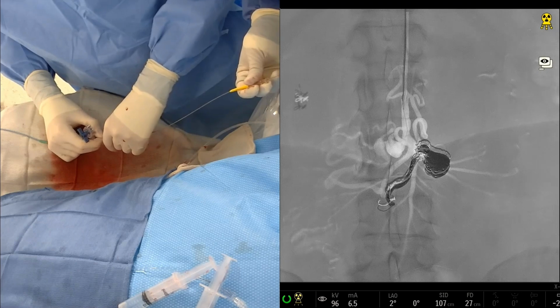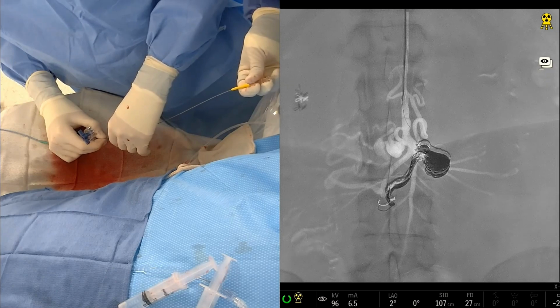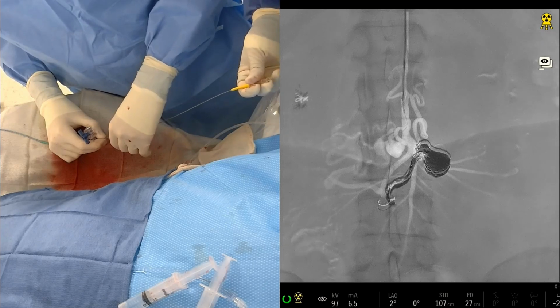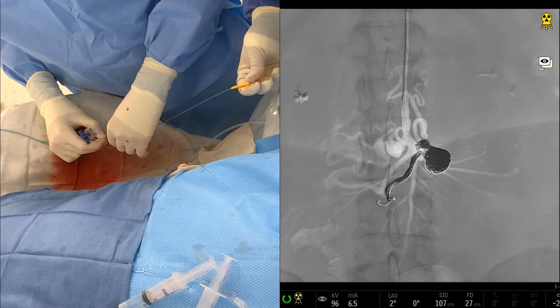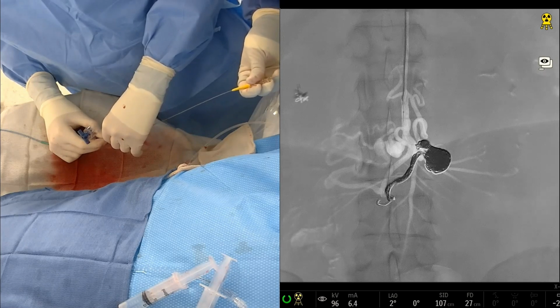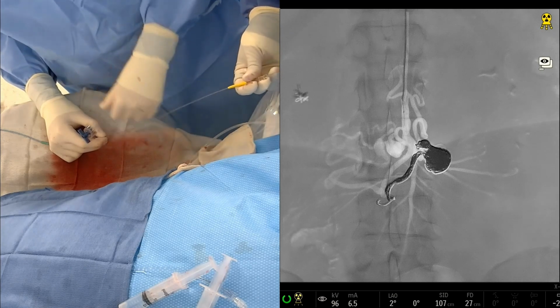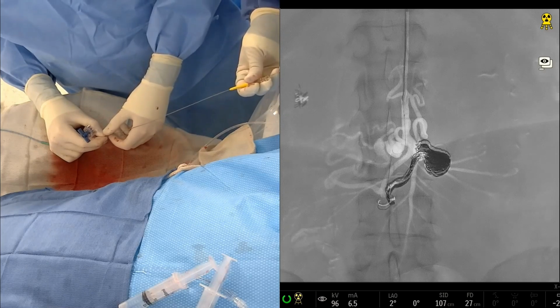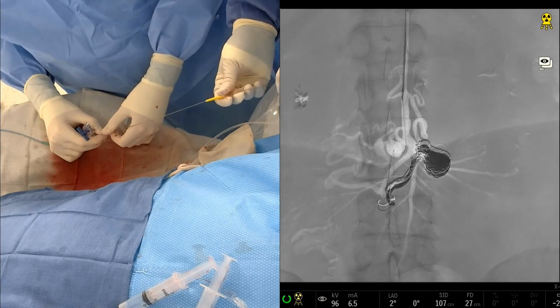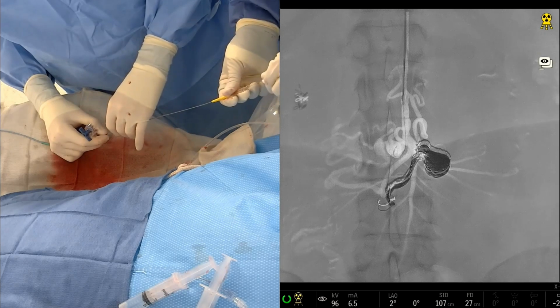Are you guys in AP right now, or are you angled a little bit? Yeah, we're in AP. There it is. Isn't that it? No, that's a different one. What wire is this? Is it the 016 Fathom you're using? Yeah, 016 Fathom. That's into that end. Right. Watching water boil. Yeah, exactly. There we go. Oh, nice. If you can go out, it's coming off superiorly.